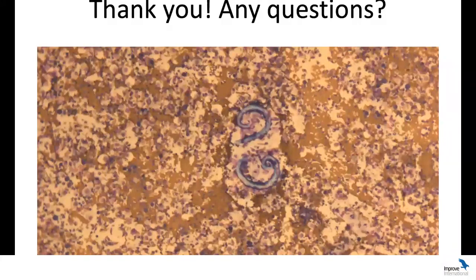It's just that when we have neutrophils, we have to consider, could these neutrophils come from the blood, or could they come from the actual lesion? If there are more neutrophils than what you usually see in the blood, then that says they were there to begin with. If they're the same amount, we won't know. So when I have samples like that in our lab, we often make a comment saying that the degree of hemodilution limits the interpretation. It doesn't make it rubbish, but you have to take that into consideration. But I wouldn't say, oh, it's got blood contamination, don't look at it. Never, because you can still have a very diagnostic slide, even despite the fact that it does have blood.